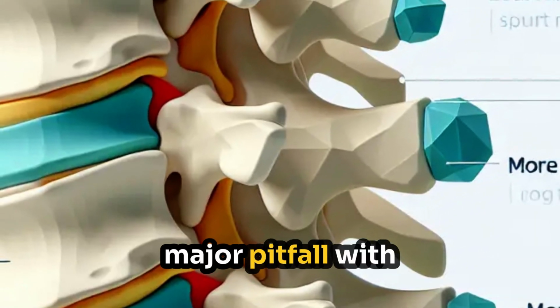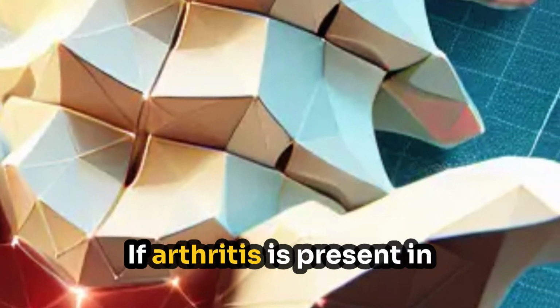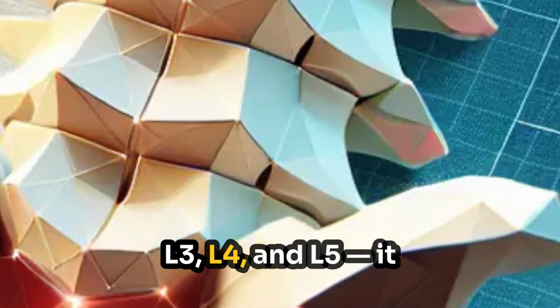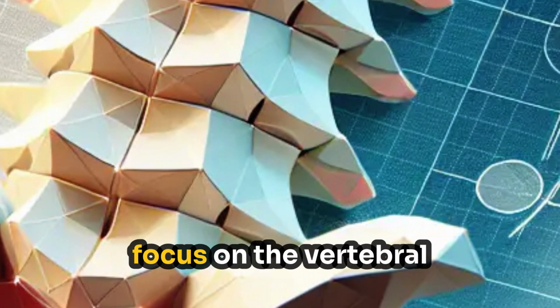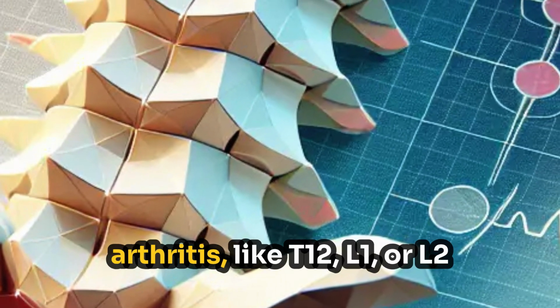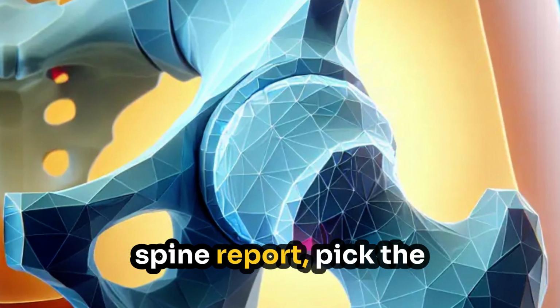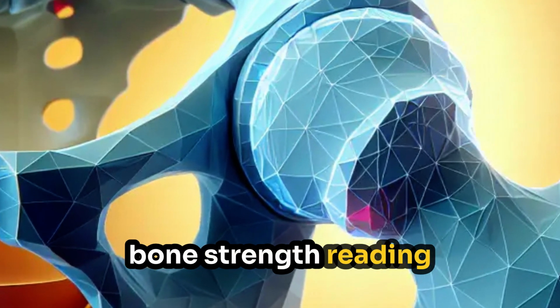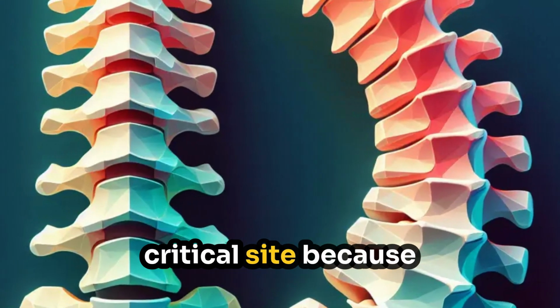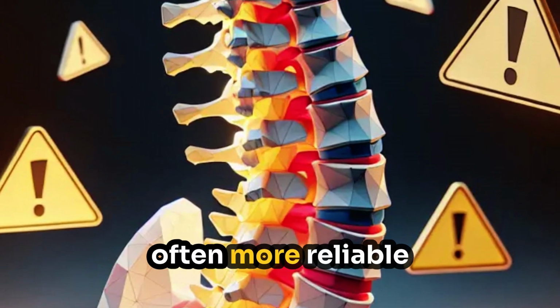Now here's a major pitfall with interpreting DXA scans. Arthritis can fake better numbers, especially in the lumbar spine. If arthritis is present in the lower spine, like L3, L4, and L5, it can artificially raise the T-score. That's why you should focus on the vertebral bodies with the least arthritis, like T12, L1, or L2. When reading the spine report, pick the vertebrae with the least degeneration for the most accurate bone strength reading. The hips are another critical site because arthritis doesn't usually interfere there, making the hip T-scores often more reliable.